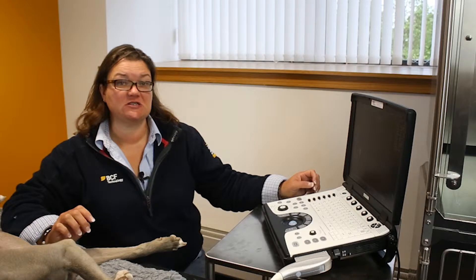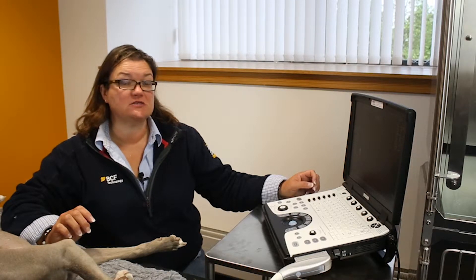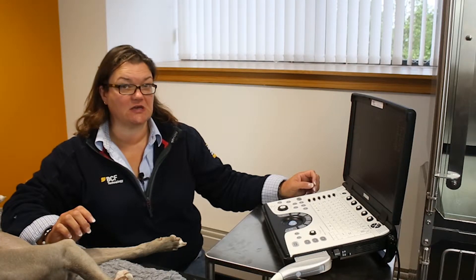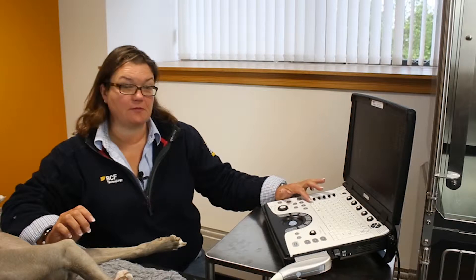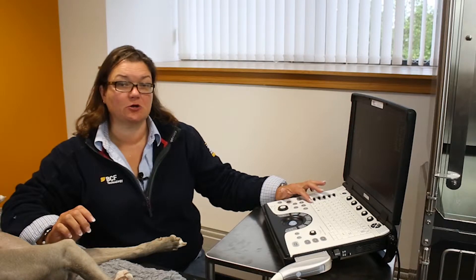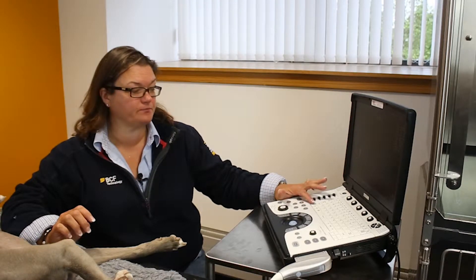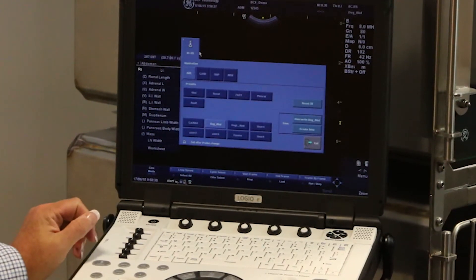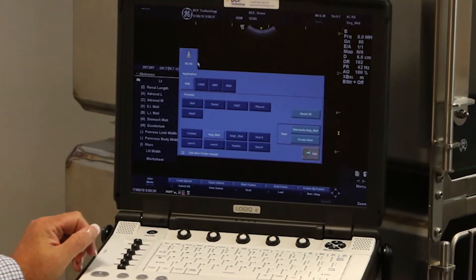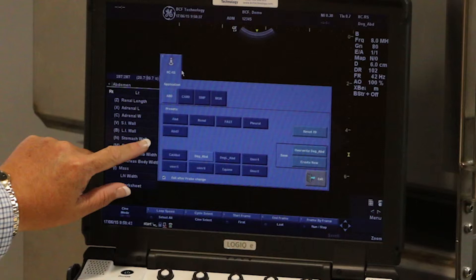Once you've entered your patient details, the next thing you need to do is select the correct preset. The preset button is on the bottom left hand corner of the alphanumeric keyboard. When you press it, this screen appears.